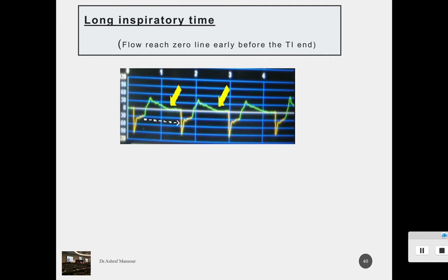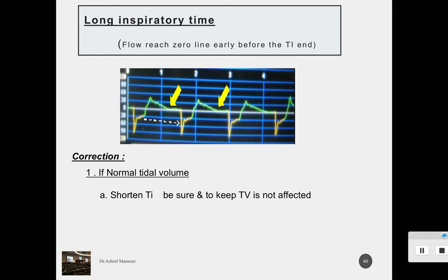We are not allowing the baby to expire. And this will cause asynchrony between the baby's breathing and the ventilator. So to correct, if the tidal volume is normal, shorten the inspiratory time and be sure to keep the tidal volume not affected.